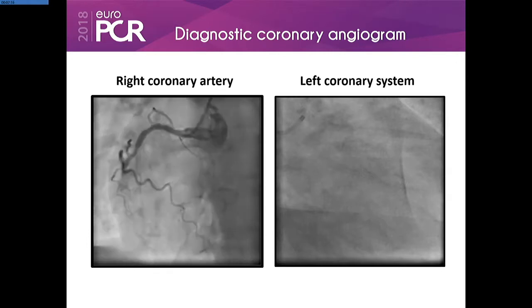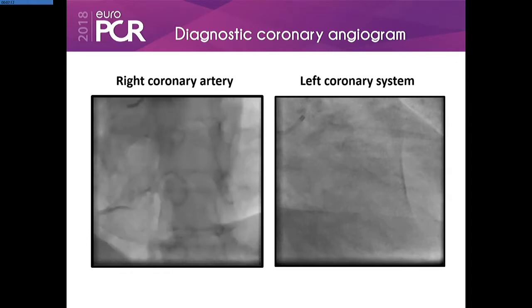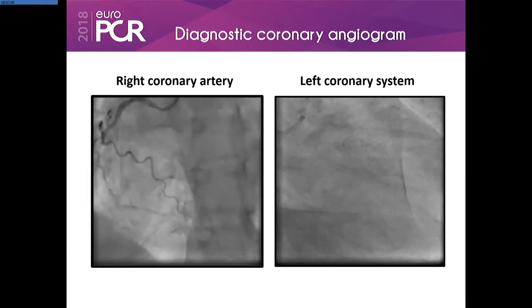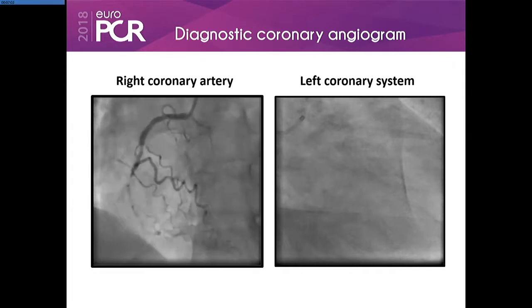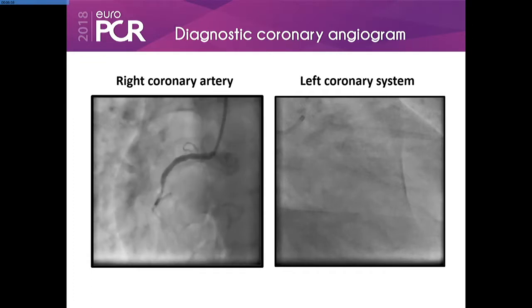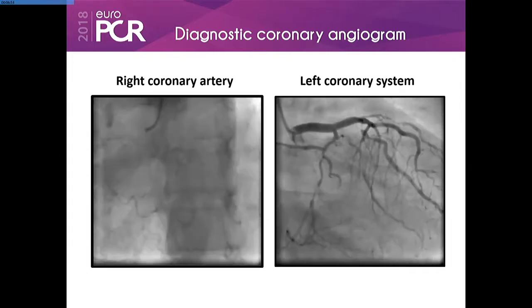His right coronary angiogram showed mid-segment total occlusion. It was clear that the proximal cap is tapered with a very short segment of CTO. Probably his J-CTO and PROGRESS CTO scores would definitely be low, with a high success rate of crossing in the first 30 minutes. He also had well-developed retrograde collaterals from the LAD.